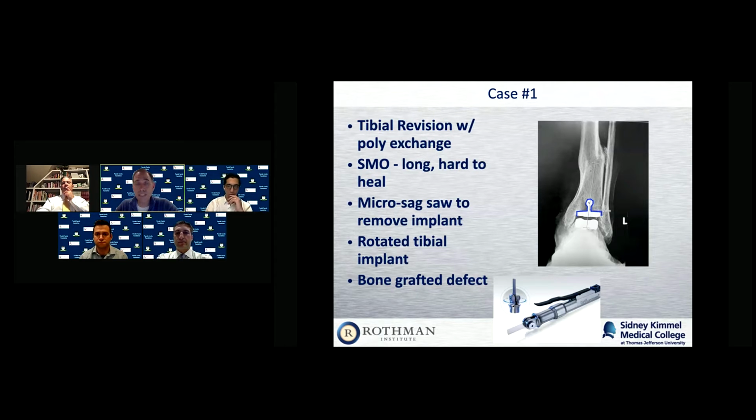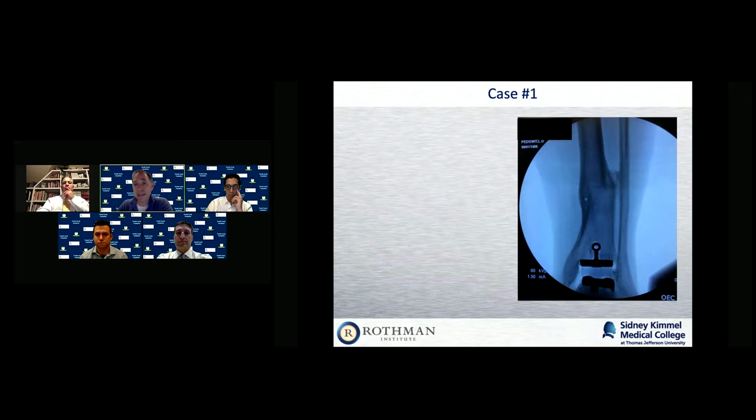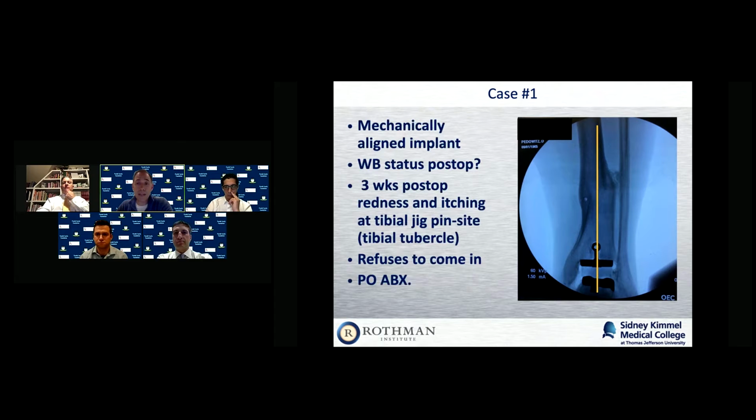And then what I did was I tilted it that little bit, right? When I tilted the implant back, it created a bit of a defect, and I bone grafted that defect. And this is what I got. I think that's nice and parallel to the fibula. I think it's reasonably well aligned to her mechanical axis. And the medial gutter is nicely opened up. That's kind of the axis. So a mechanically well aligned implant.